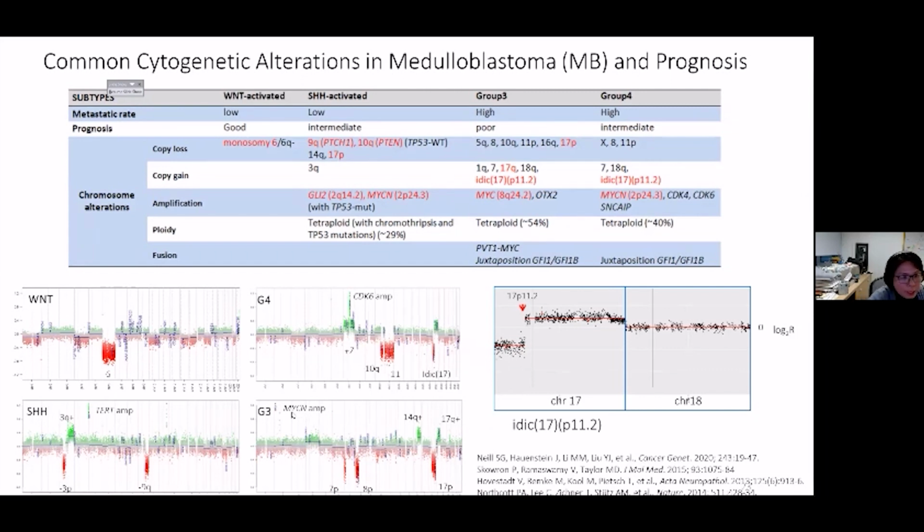There are also gene amplifications and some distinctive deletions in group 3. Medulloblastomas are represented by a higher number of reference cases and are among the best-defined groups in the classifier. So it is believed that a failed classification should prompt consideration of other tumor classes not included in the classifier, such as non-defined embryonal tumors or metastases.